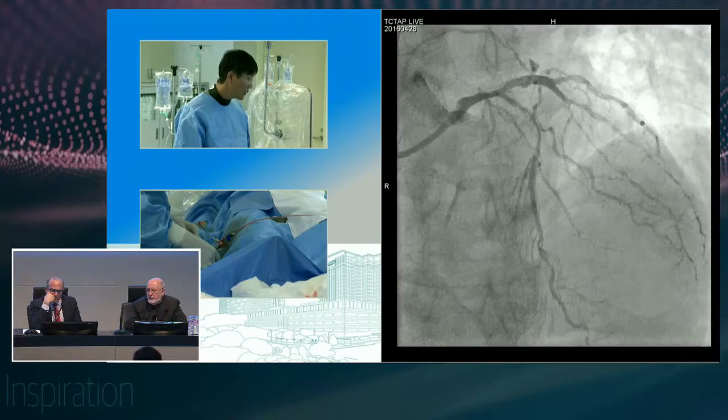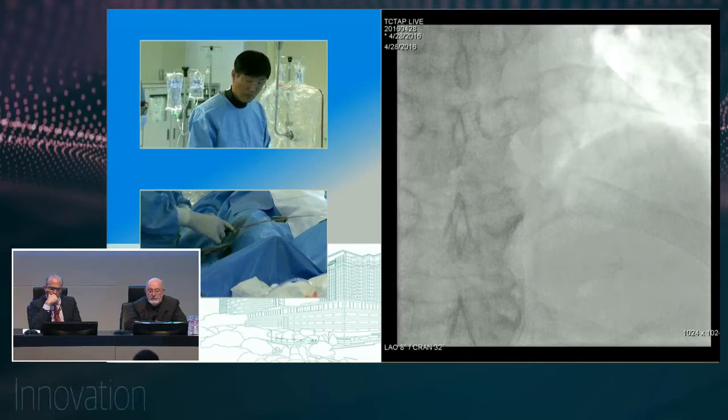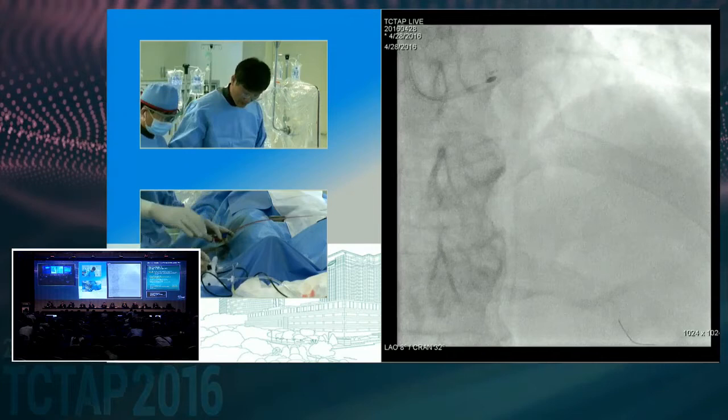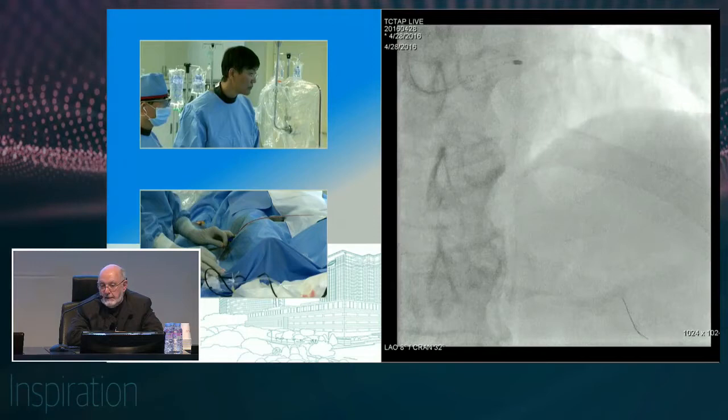Except that you've already done rotational atherectomy. Yeah. And you've already modified the plaque somewhat, because you never get rid of calcium. Even if you image after 1.75, it's not going to look much different. And that doesn't mean you go to a 2.0. Yeah, I totally agree with that. Just modifying the plaque. It's also interesting that after a 1.5 burr, you have areas that are 1.75 to 2.0 in terms of MLD. And that's also been an observation that goes back 20 years.